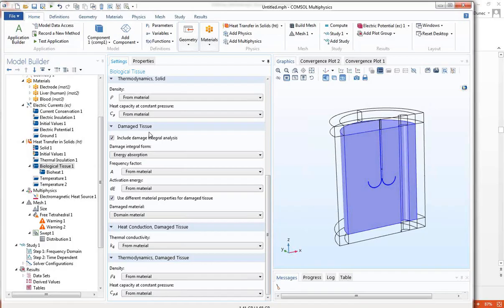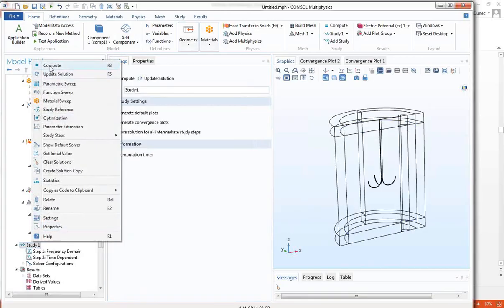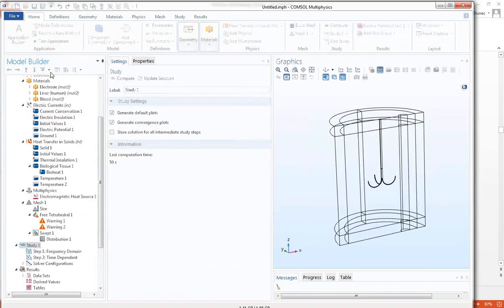So now what we can do is turn on and off things like capillarization. You get the full features of anywhere you type a number, you can type an equation. So just for fun, I've set that up. I'll right-click and hit compute. You can see that nothing else had to be done. All you do is just turn the thing on.